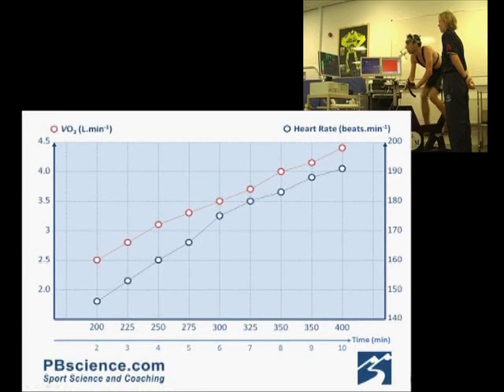Heart rate, shown here in this graph in the blue line, also develops in a linear fashion.